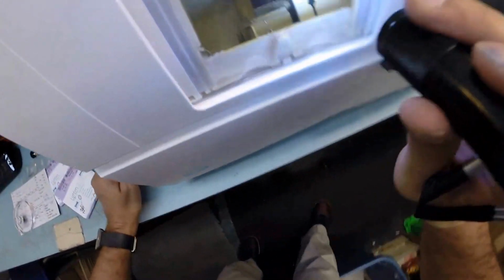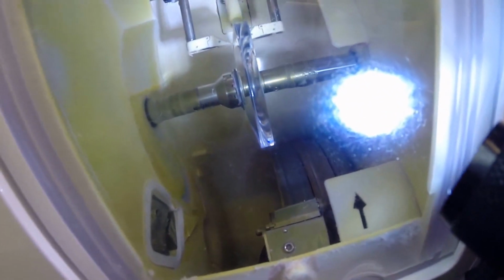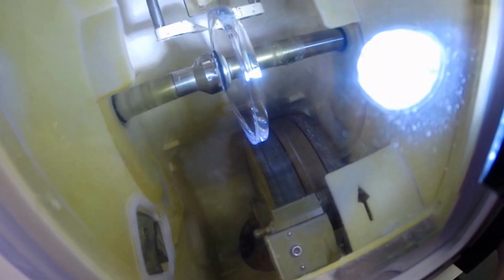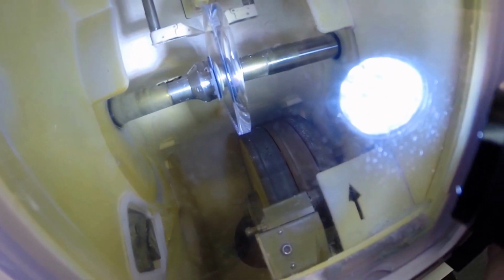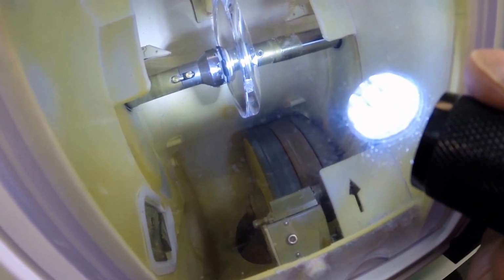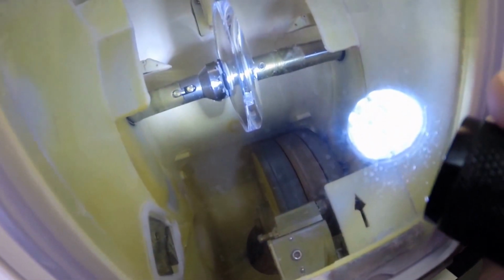I'm going to hit that green button, which is to get my hand out of the way, which is start in every language. That clamp's going to shut. And then two white styluses are going to trace the shape of the lens to make sure it's large enough to fit into the frame. You can see as it's going around tracing. And the old carpenter saying, measure twice, cut once. It's going to measure the thickness of the lens at every point to know exactly and precisely where to place the bevel so you have the least amount of edge thickness showing. Essentially the best cosmetic look possible as well.